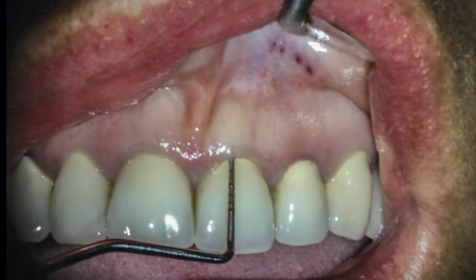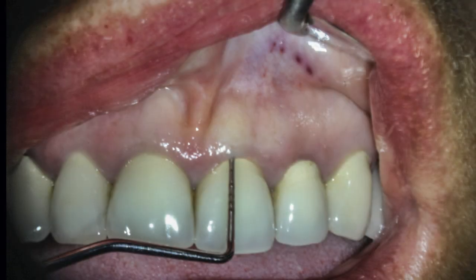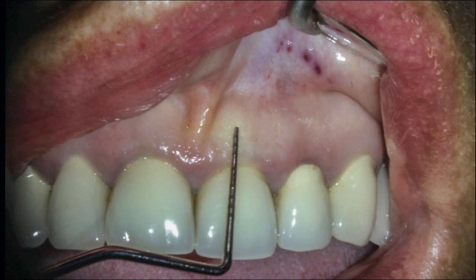Before creating a flap, I always like to bone sound. I want to have a good idea of where that alveolar crest is — it helps me design the flap. Since we're dealing with aesthetics here, I'm going to consider a sub-marginal flap, but we need to make sure the supporting bone underneath can support that. There's about a three-millimeter probing depth here, which tells me that if I can make an incision about five millimeters apical to that gingival crest, I can keep the incision line within alveolar bone, making it a good candidate for a sub-marginal incision.